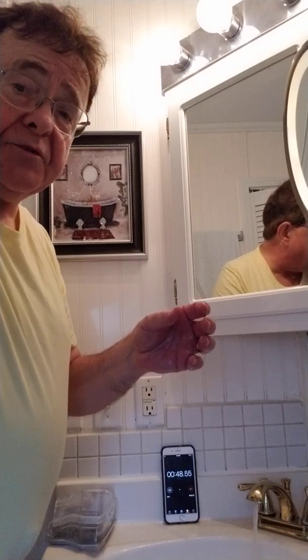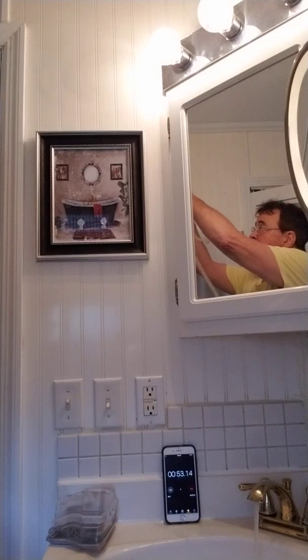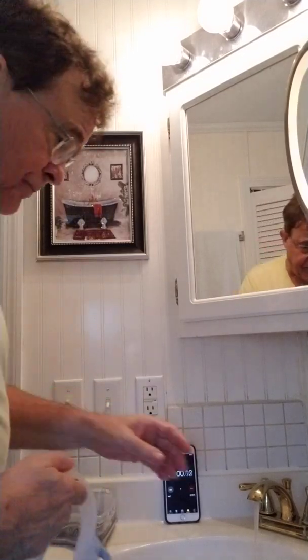I let these things air dry, by the way. I know there's some people that buy the hurricane dryer, and that's great and everything. It gets everything absolutely dry, but I don't think you really have to even do that.